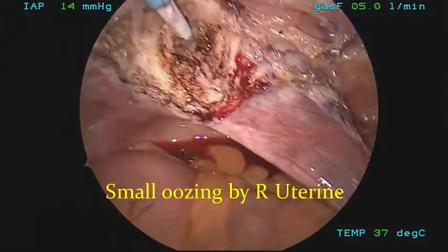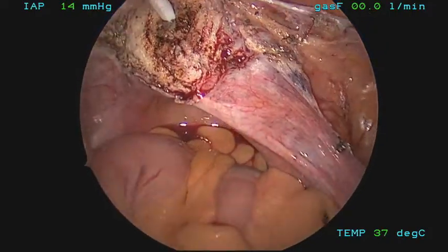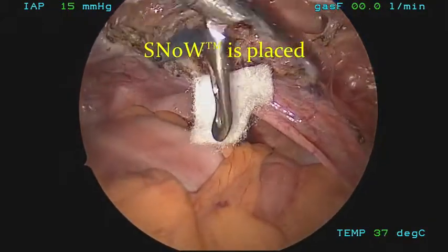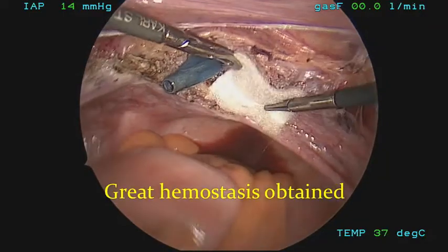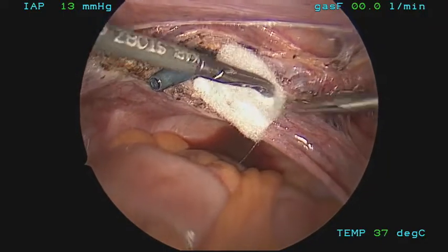Now the pelvis is inspected. There's some slight oozing at the place of the uterine artery on the right side. This is easily handled with a hemostatic agent such as snow — you can gently place that there. We try to avoid cautery in these regions as much as possible to prevent any damage to the underlying ureter.